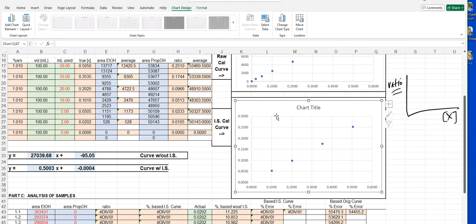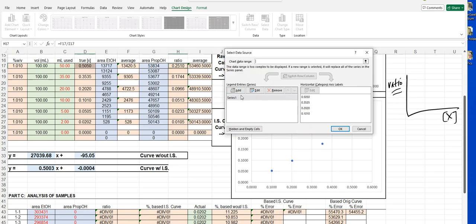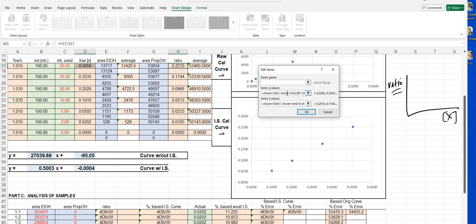It looks like I actually forgot a number here. So let me do this again. It looks like I forgot to select the blank. So if I'm going to go back. Oh, what have I done? What have I done? I'm just going to delete all of this again, just so we can start fresh and clean. Doesn't that sound good? Fresh and clean. The only way to be in BAC. That even rhymes.